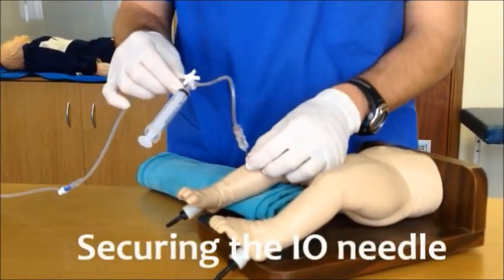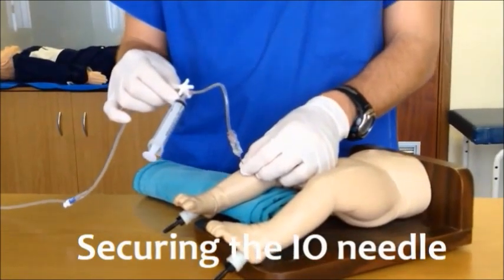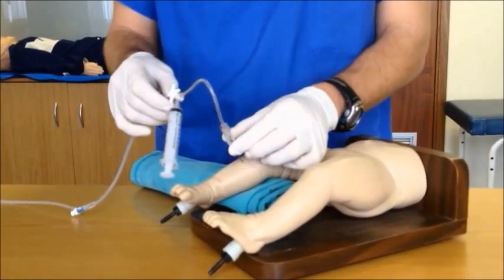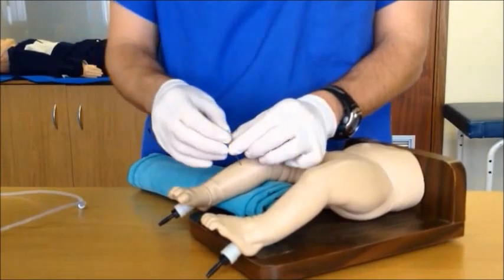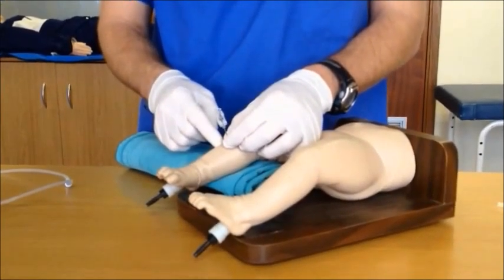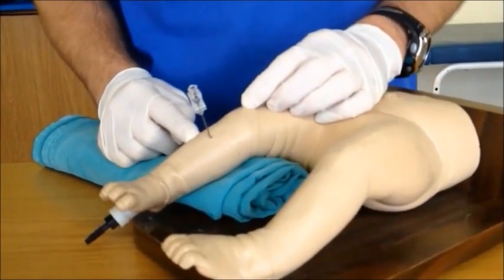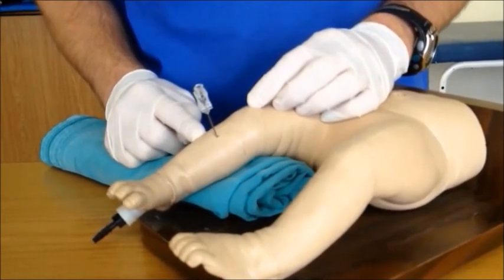Once all initial life-saving medications have been delivered, securing the intraosseous needle is an option. In order to demonstrate one technique for doing so, I will now remove the giving set from the back of the needle. Please note that when you are actually doing the procedure, you would not disconnect and would have an extra assistant to help you. All techniques for securing the needle to the patient's leg carry the risk of dislodging the needle or increasing vascular compartment pressures.